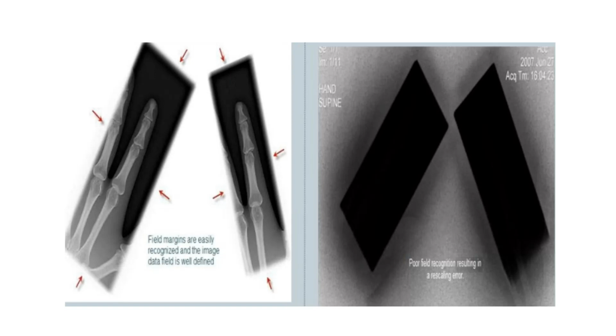Here's another example. You put that little lead square up against the person's back when you're doing a lateral lumbar spine to cut down on the scatter. But if you have this density maybe that's caused by that lead strip being in the field, maybe the computer gets confused. I'm not saying don't do it. I'm just saying be wary and look at your images.